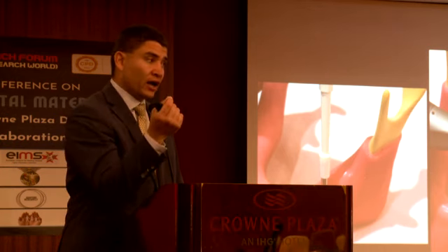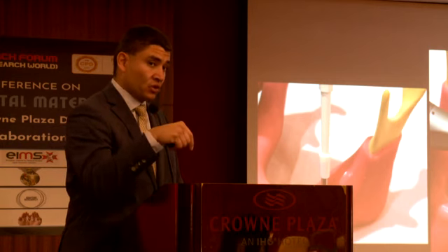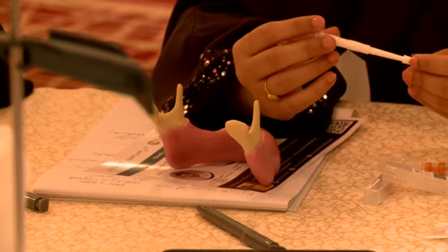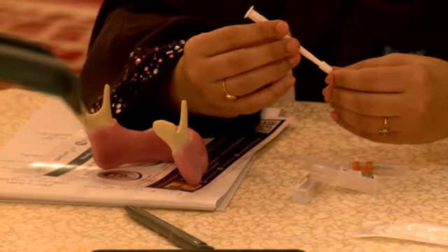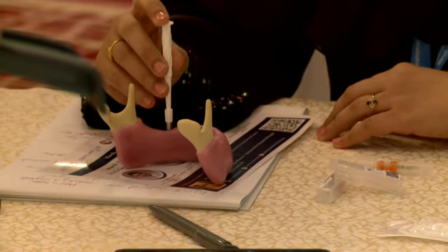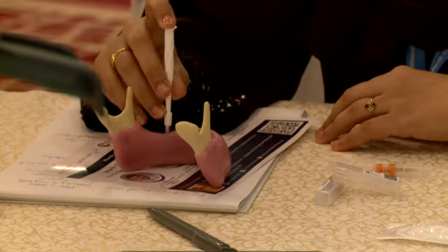You will feel how the drill engages into the bone right away. You could use it as low as 50 RPM or as high as 2,000 RPM. Go ahead and try that and see how easy it is to drill through that jaw.